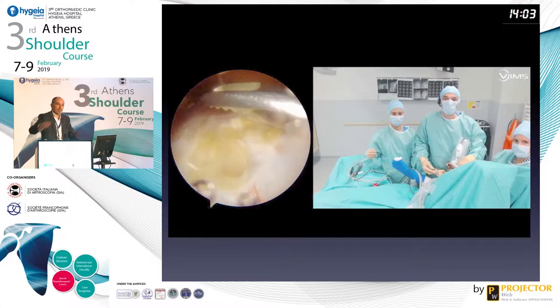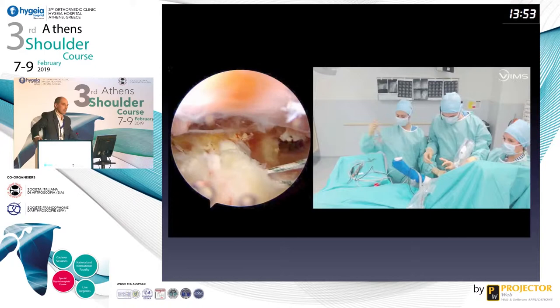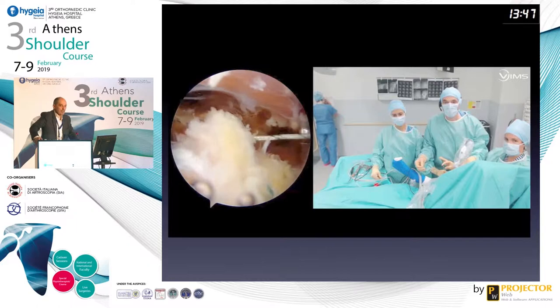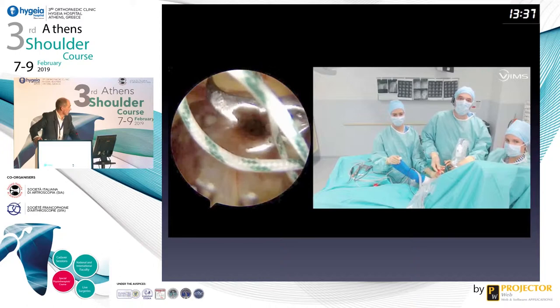And you take the sutures, and it's very important to make a Krakow suture, because otherwise you can rupture your transfer. It's so thin, and so easy to make with an open procedure. Arthroscopically, you can go crazy. And in fact, as you can see with my assistants, it's a four-hand step.